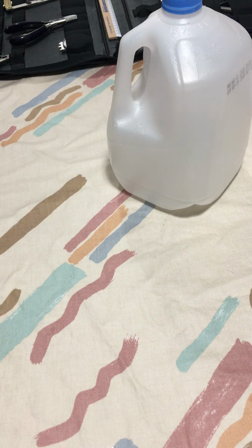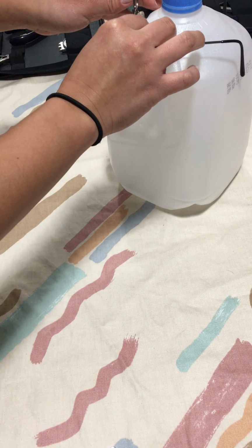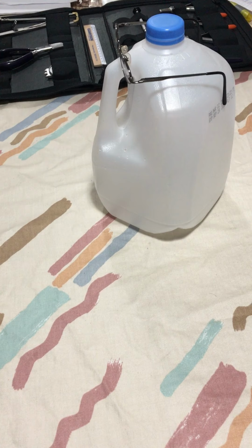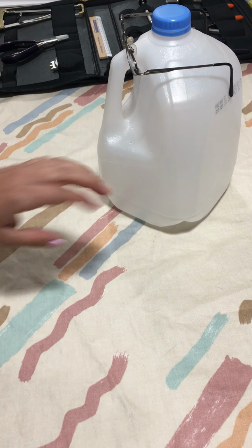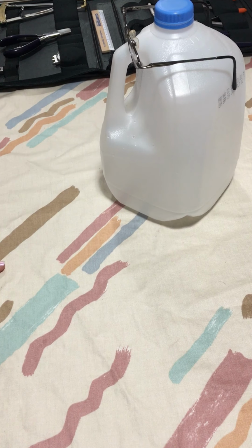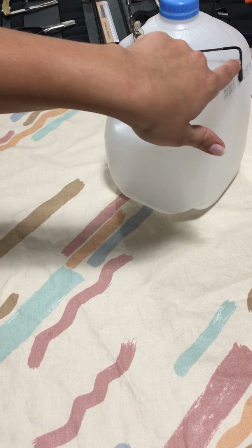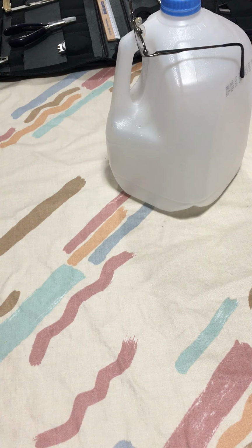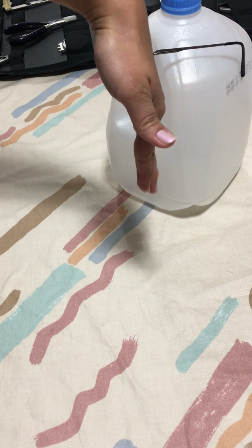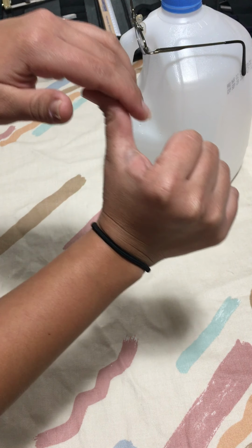The next misalignment we're going to be checking on the patient is going to be this one. Okay, so from what I could tell right here, just by looking at it, I see that the temple bend does not go all the way down. It stops right here. So if the patient's ear was right here, all of this would probably be showing. Also, I could tell that the temple bend has an almost 90-degree angle going down when it's supposed to have like a 45, close to your finger type of angle.